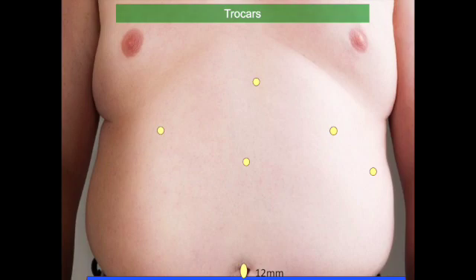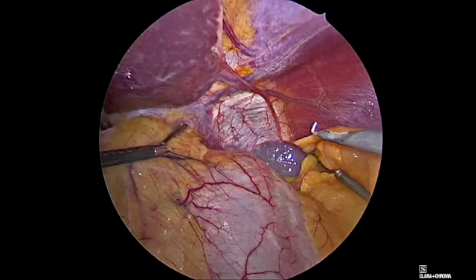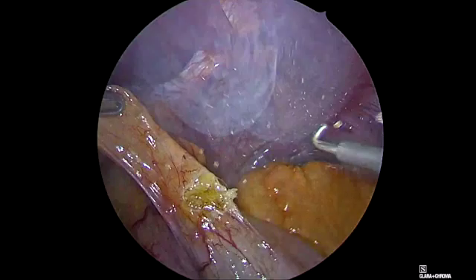We are very economical with large trocars. We put the 12mm trocar inside the umbilicus where it's well hidden, and frequently there is a small umbilical hernia there that we take the opportunity to correct. The specimen is also retrieved through the umbilicus. Another 12mm is put in the lower left flank, and an additional 5mm in the lower right flank so the surgeon can work comfortably. Here we see the 5mm liver retractor and the surgeon working from the two top 5mm trocars.